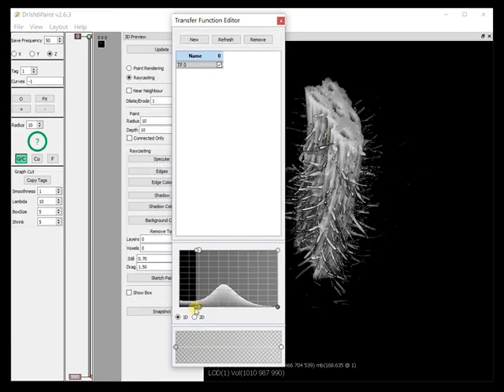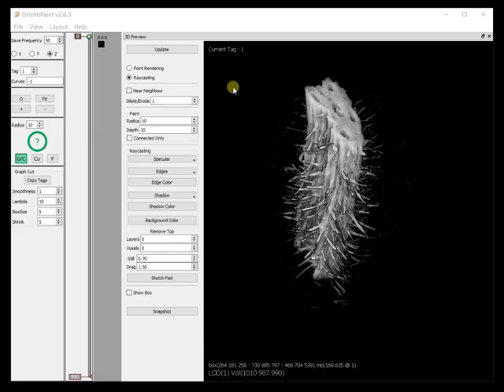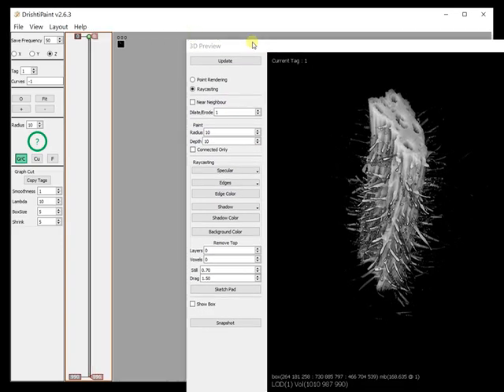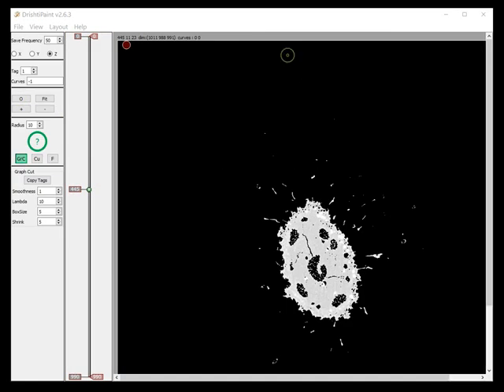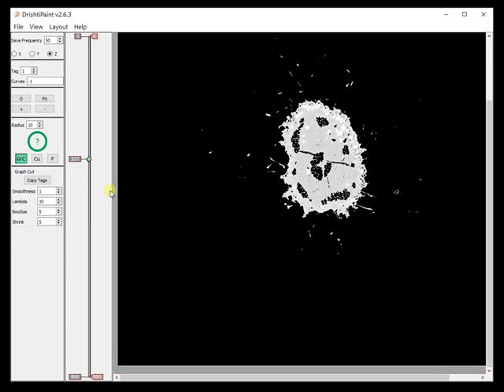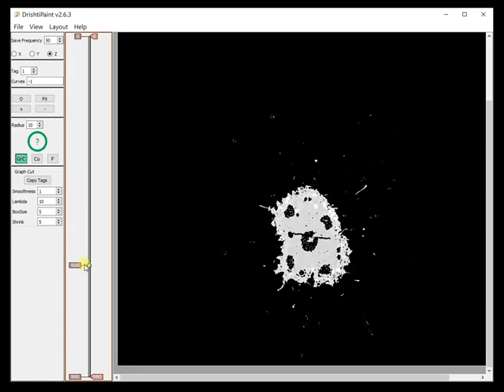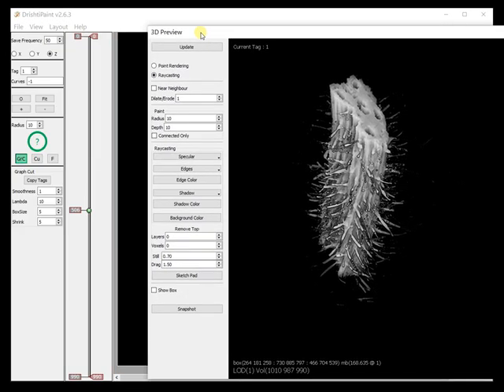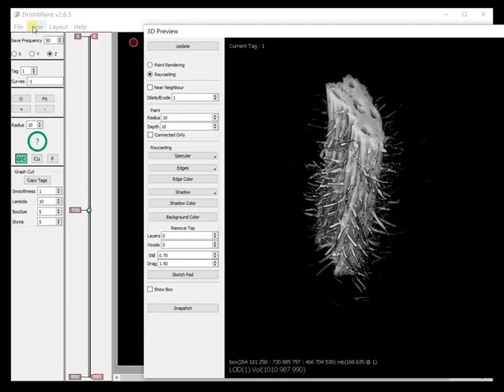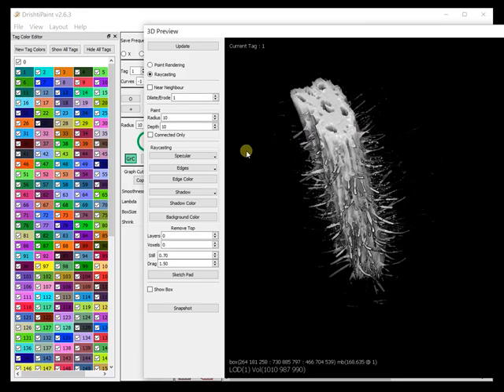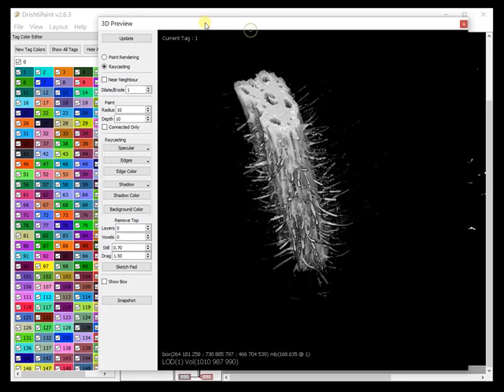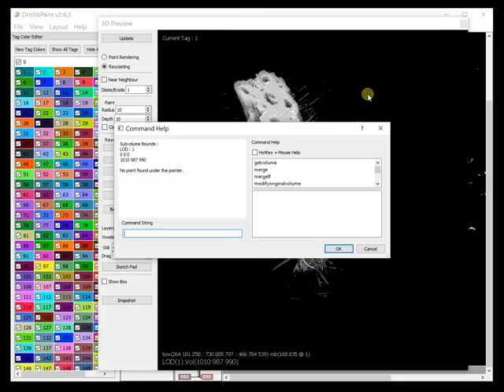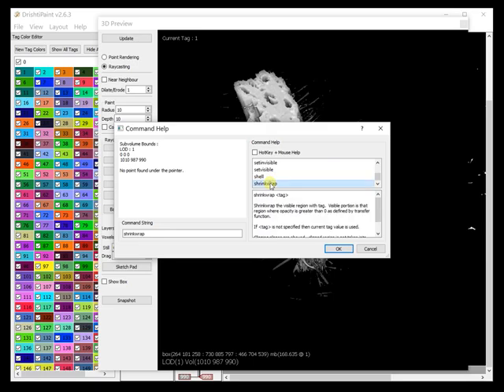Let us shrink wrap the stem. This is the data and we would like to extract these vessels. Let's select tag one and apply shrink wrap. To apply shrink wrap press space bar and then shrink wrap.